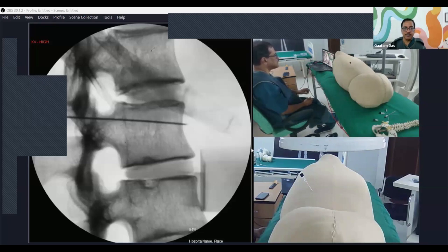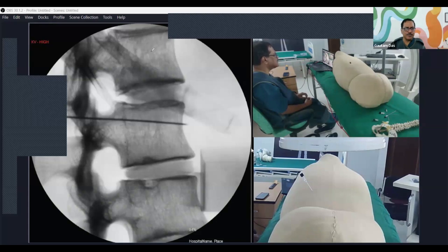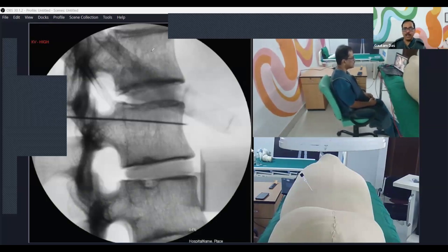So for the pacemaker, you have to go for the bipolar. Put 2 needles nearby and go bipolar. Okay? So do we have to change any configuration in the pacemaker, or can we do nothing? You just do a bipolar. Bipolar means the circuit will be completed there. It is not going to go inside the body. So that means it will be very safe for the pacemaker patient. You have to go for the bipolar RF.